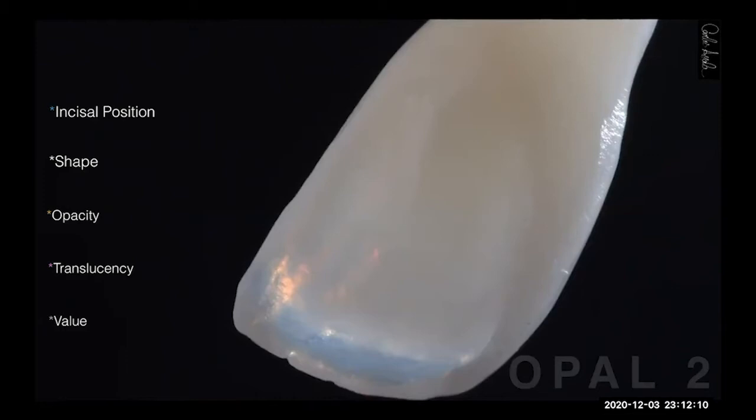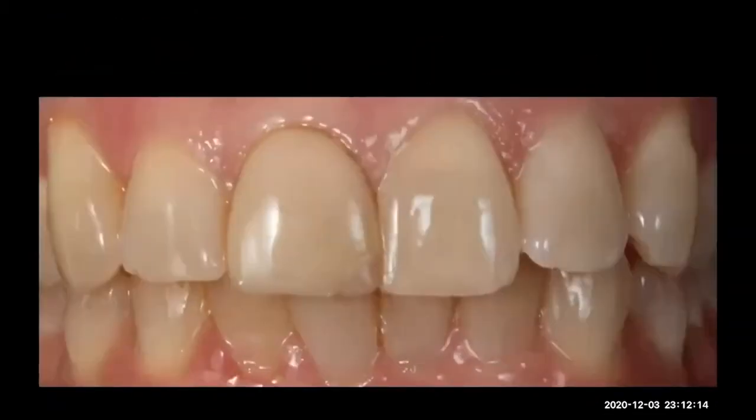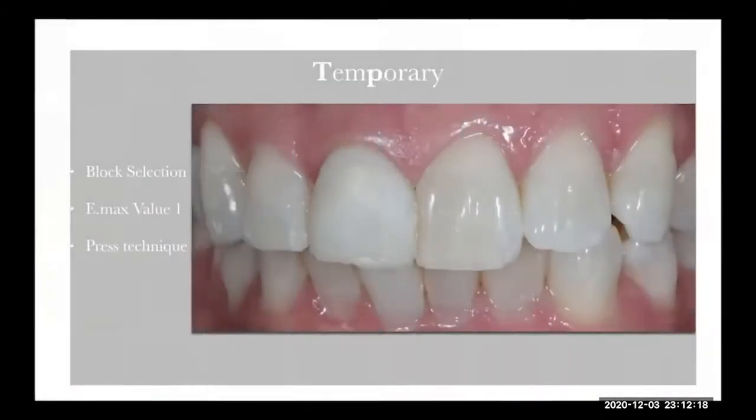So let me show you my first case. This is the initial situation of the patient. We decided to do a bleach, okay? So in that way we pick what kind of ingot we want to use, and the technique and everything.